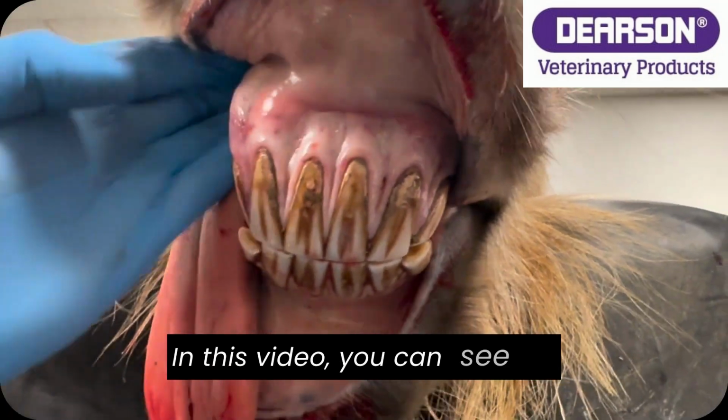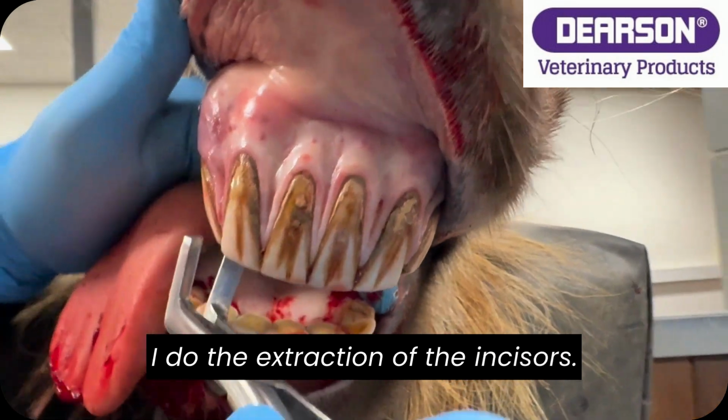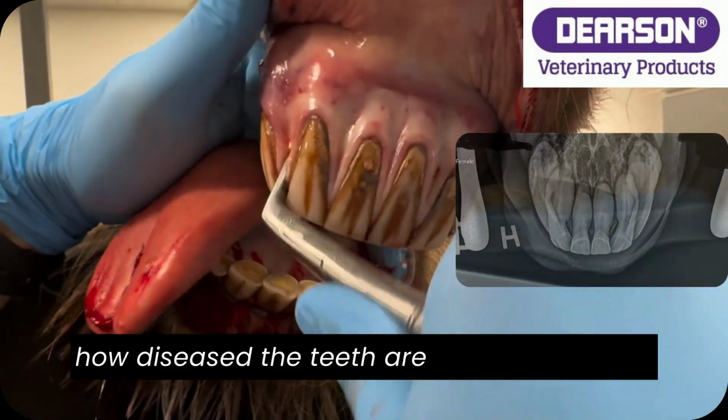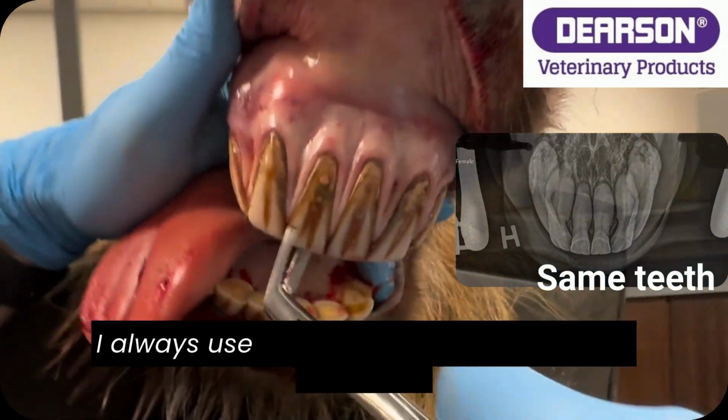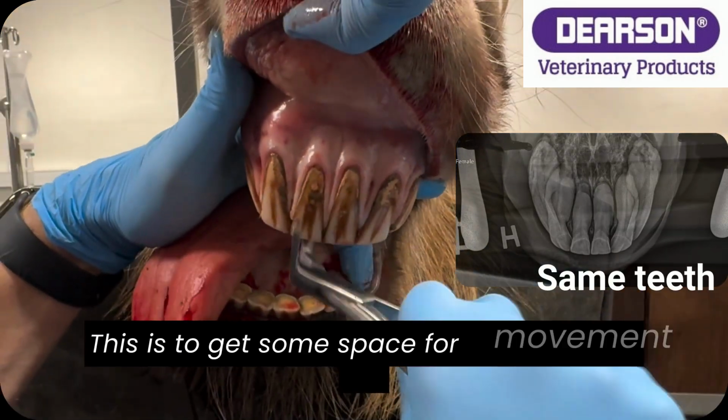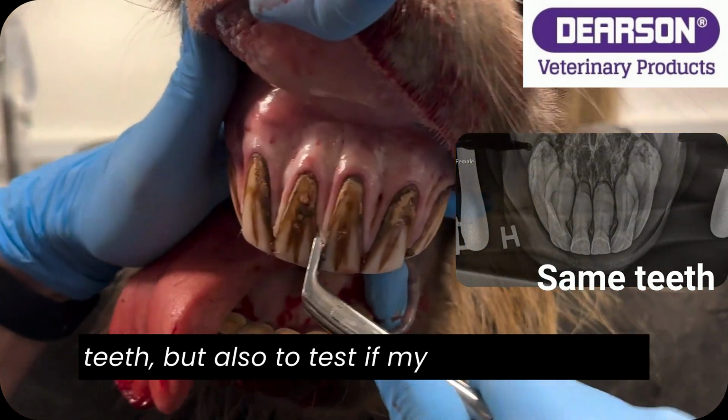In this video, you can see how I do the extraction of the incisors. How easy you can do the extraction will depend on how diseased the teeth are and in what way. I always use the spreader between all the teeth first. This is to get some space for movement of the teeth, but also to test if my block is working.